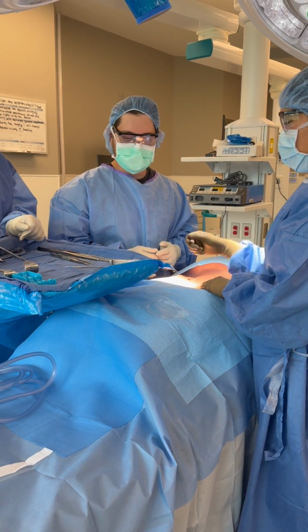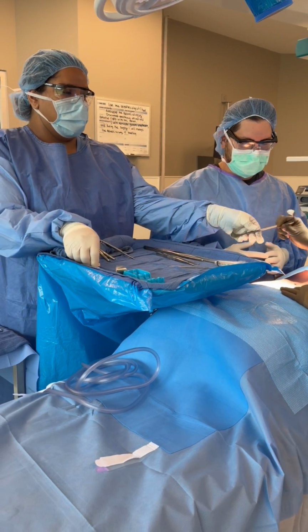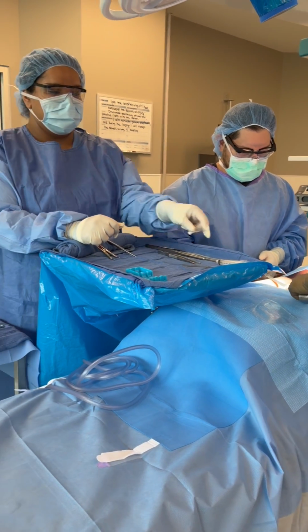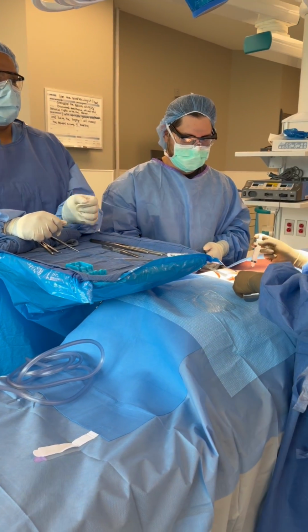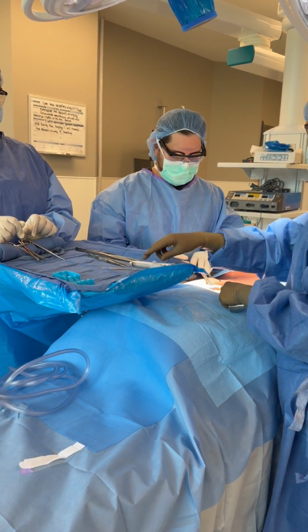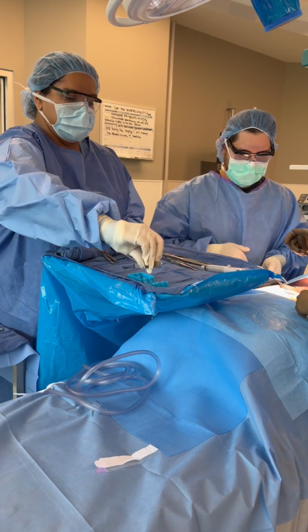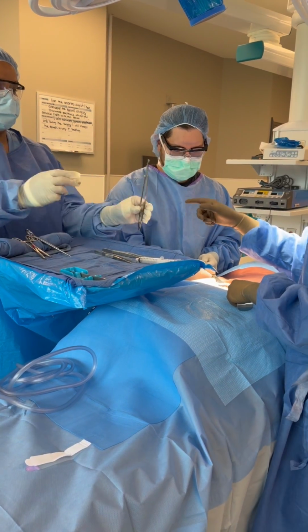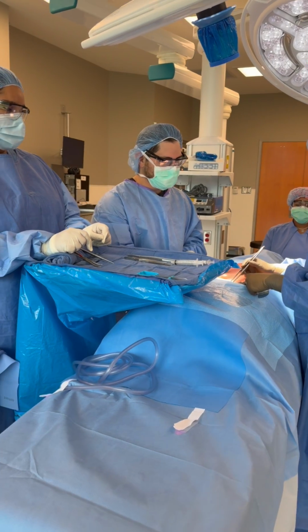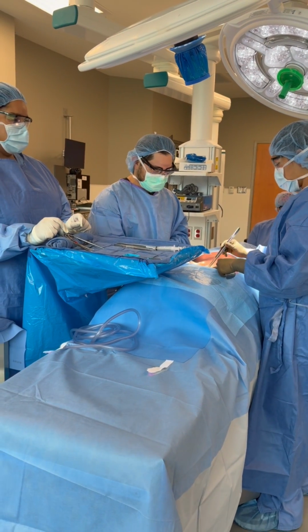Okay, can I have some retractors? Okay, can you please hold it? Local. Okay. Some forceps. We're going to remove the cervix and the uterus.